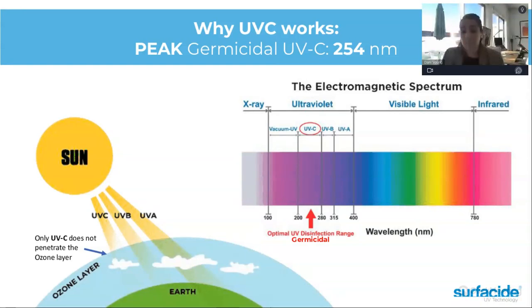Let's see. Any other? I've already invested in hospital grade air filtration systems in every room in the office. Is the UV process better or just different? I would be curious what kind of air filtration they're doing, if it's ozone or if it is UV in the air filtration. I think those are just two different technologies. Like we said, ozone is a chemical that you don't want to breathe in.